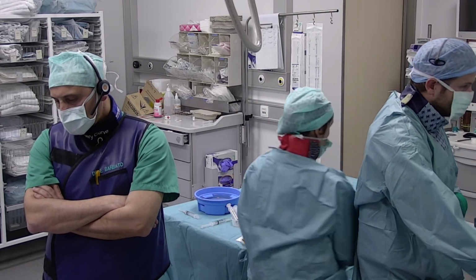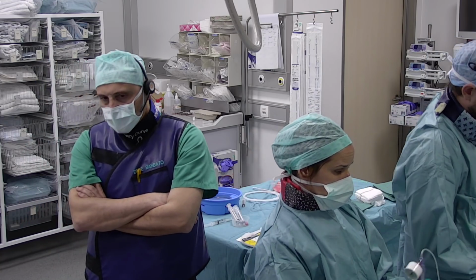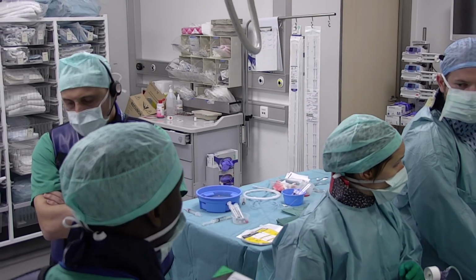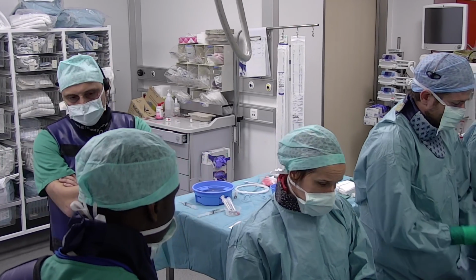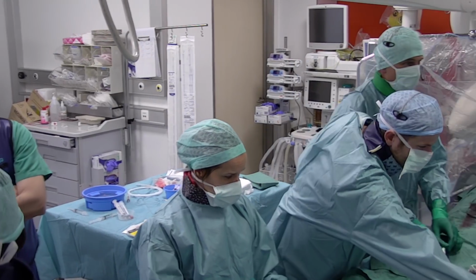So let me ask the colleagues whether they agree to take at this stage a bigger balloon to do POT. Just for the sake of your information, we have post-dilated this stent with a 4 semi-compliant balloon. What Bernard is asking is a 4.5 millimeter balloon to perform a POT. With the bigger balloon, do you agree?